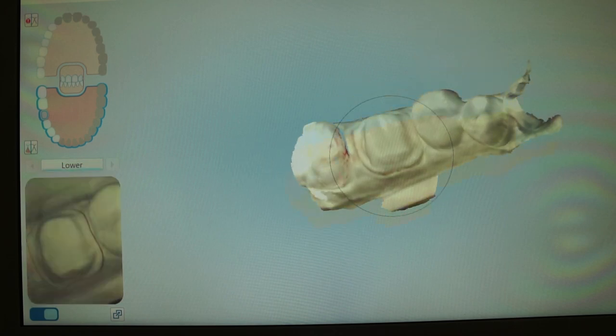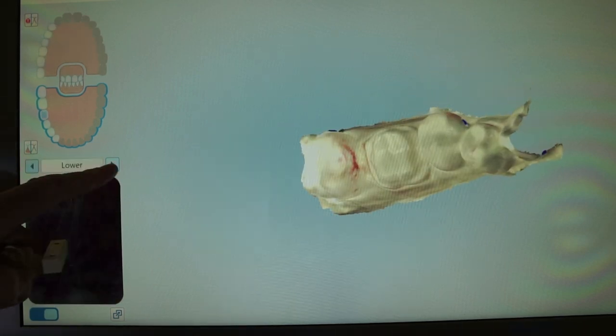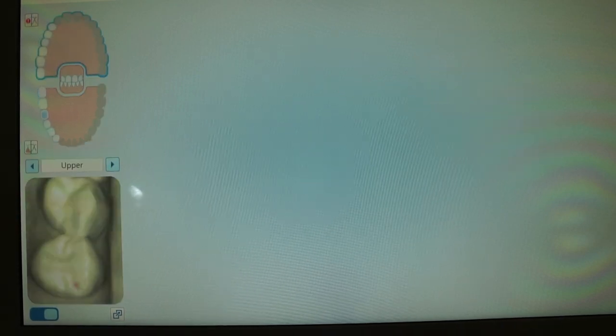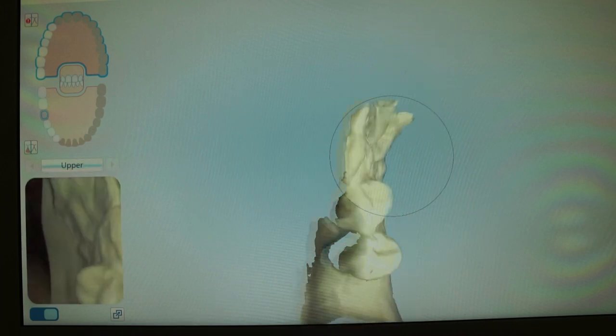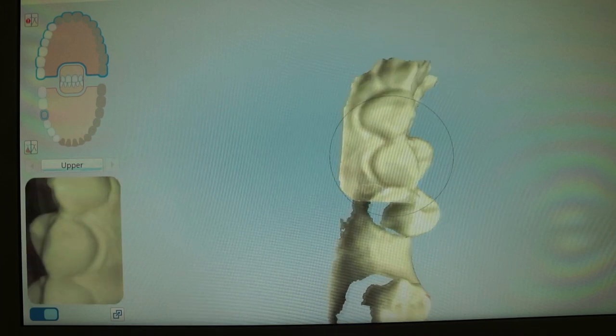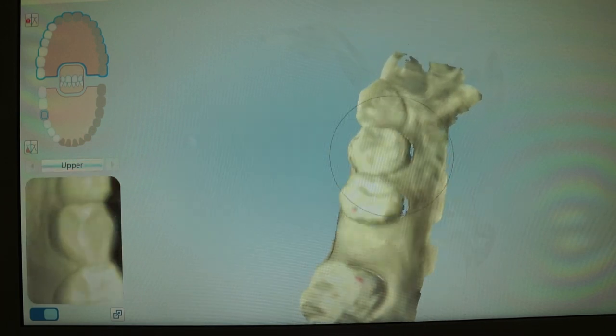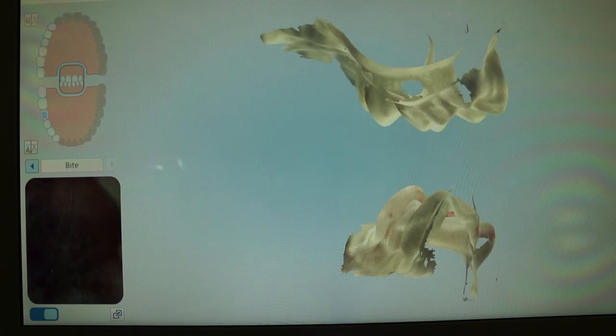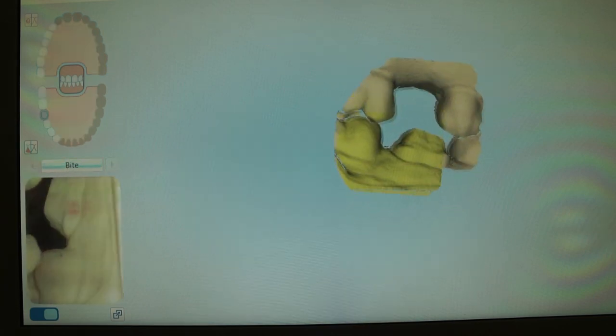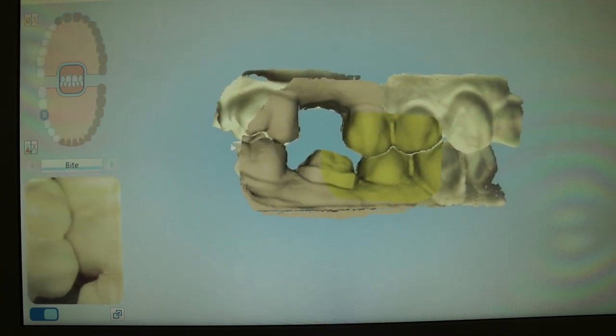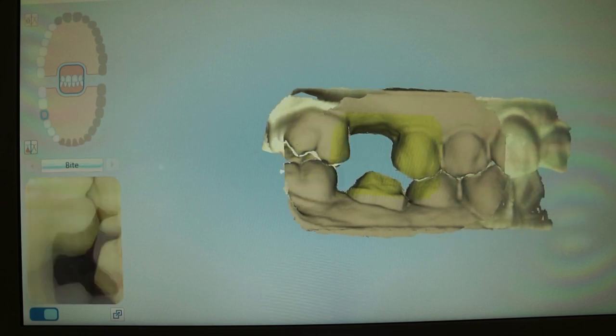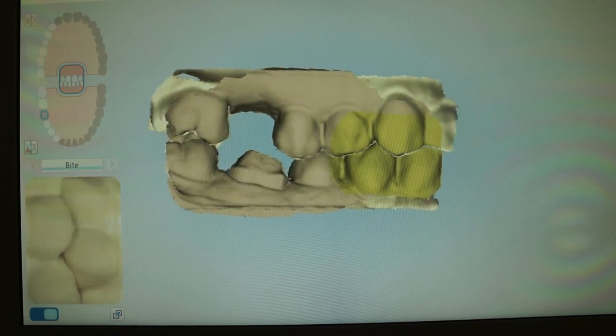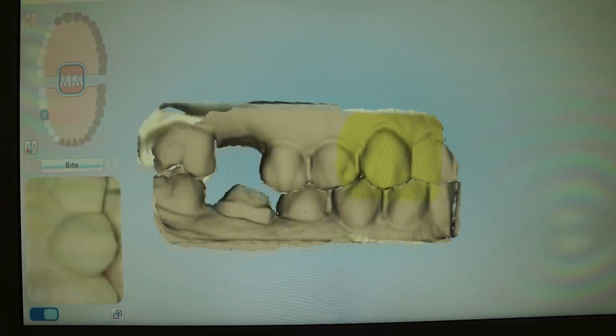And then you're going to scan the rest of the arch. Basically, at this point, you want to try to get all the proximal contact data to make sure that you're able to build an accurate contact. Here we are scanning our opposing, making sure we have plenty of information on the buccal so that we can align everything within the bite tab as we are doing here.